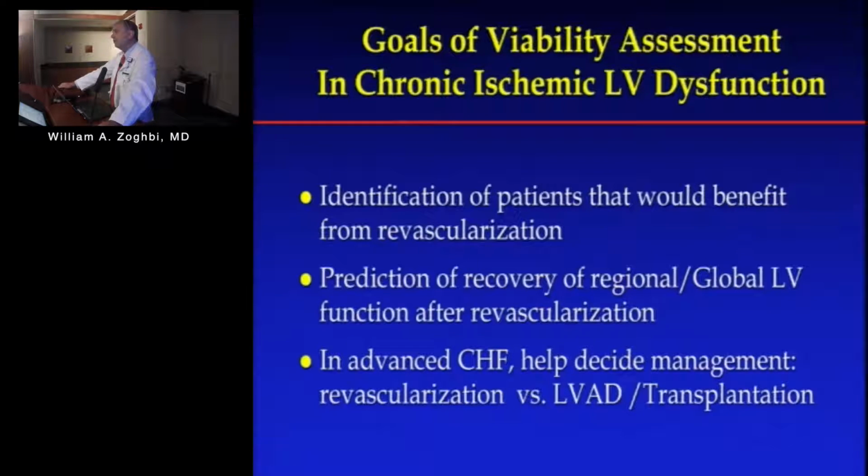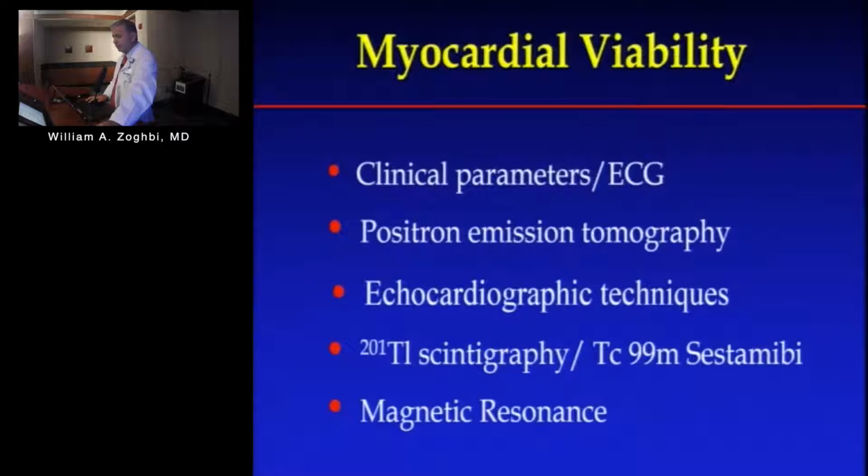Identify patients that would benefit from revascularization. Now, at times people who have angina and other things have viable myocardium, but here the big question is really number 3, which is, in advanced congestive heart failure, help decide management, revascularization versus some other form of therapy which is very different, which would be LVAD or transplantation. Because there are techniques that are quite specific in telling us about viability of the myocardium. There are techniques that are quite sensitive. So in those situations, I think people would err for some specific techniques to go forward with that evaluation.